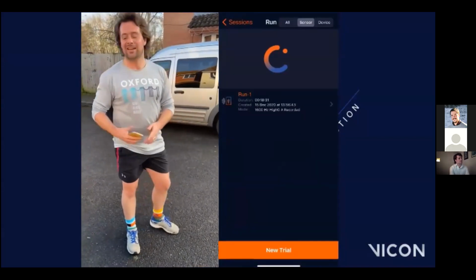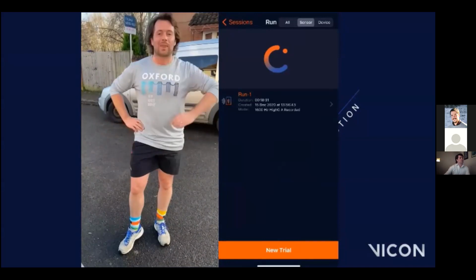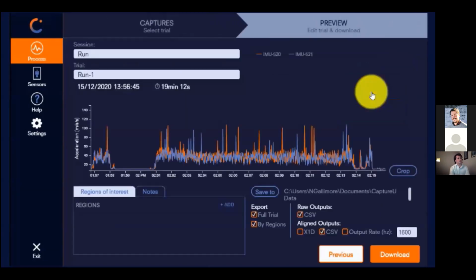Okay, so now that I've got the data I captured, it's time for me to take these off, put them into my PC, and download the data. I now have my sensors connected to my computer, and I've opened up IMeasureU Desktop where you can see my trial listed. To preview the data, select Edit and Download.